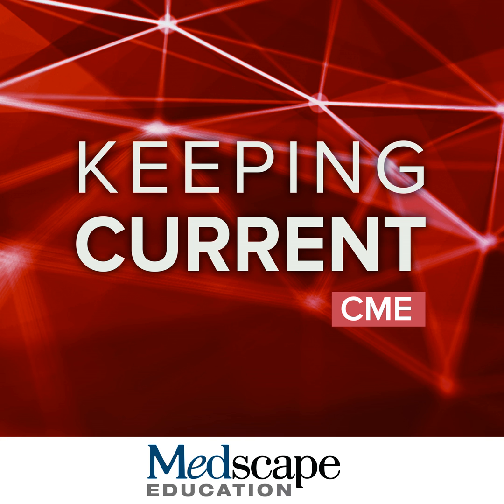So just to finish up, what are the key points? Well, the basic CMR protocol is very simple if you use cine imaging and late gadolinium enhancement imaging, and can be used to assess most cardiovascular conditions. Contrast enhanced MR can be carried out at lower doses of 0.1 to 0.15 millimoles per kilogram. Late gadolinium enhanced techniques are now simple and easy to implement, and most artifacts with CMR can be corrected with simple measures. So thank you for your attention.